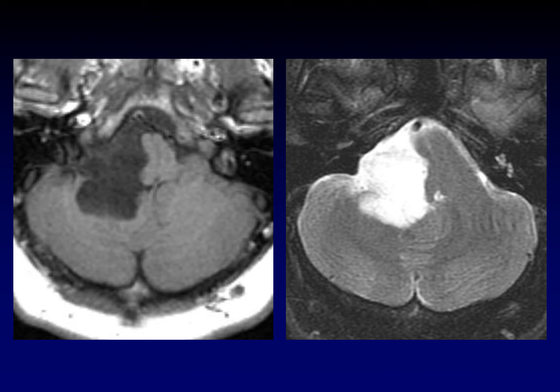Here is a classic example of a cerebellopontine angle cistern mass that belongs in the differential of epidermoid versus arachnoid cyst. You can see that it is the same color as CSF on T1 weighted images. It is the same color as CSF on T2 weighted images. How are we going to tell these apart? We're going to look at other sequences.